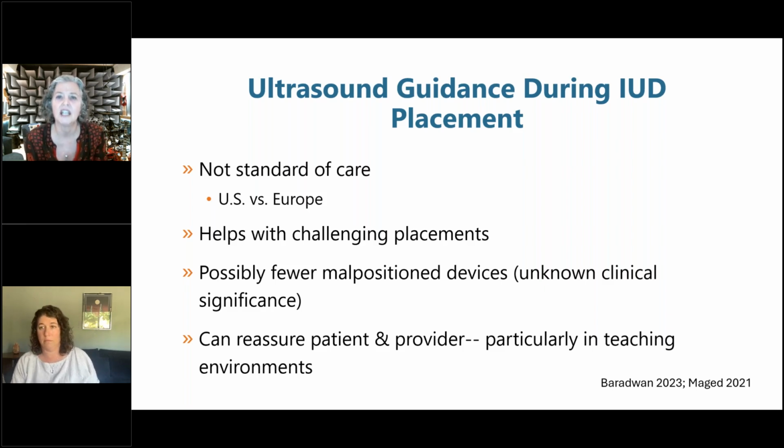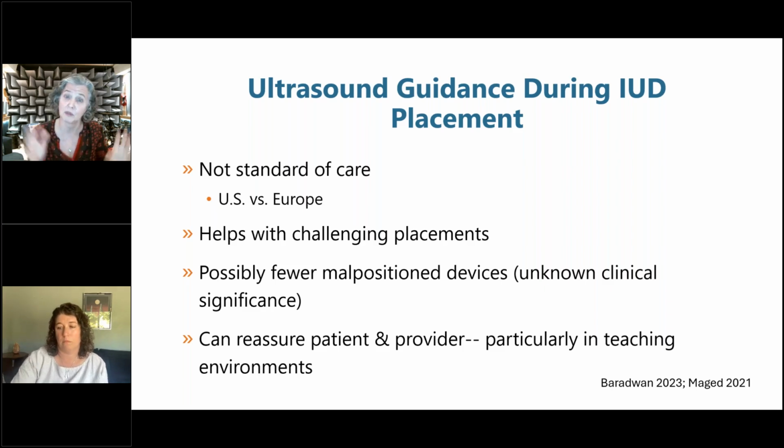So if you do have something that becomes challenging and you have access to an ultrasound, that would be the time to take a little break, get the ultrasound in the same room as the patient, and then try doing it with ultrasound guidance. We do know that in studies, there look to be fewer malpositioned devices when ultrasound guidance is used. However, what we don't know is whether those malpositioned devices have any clinical impact whatsoever, because a lot of devices are not in exactly the perfect position up at the fundus, but they don't have any problem associated with that.